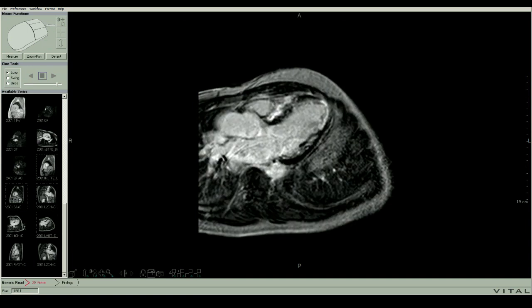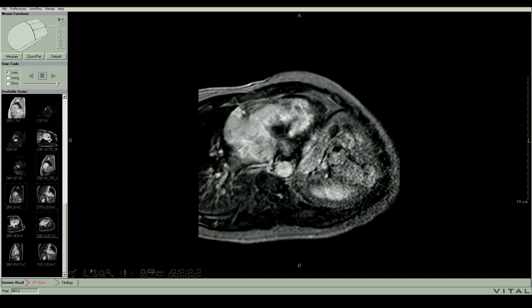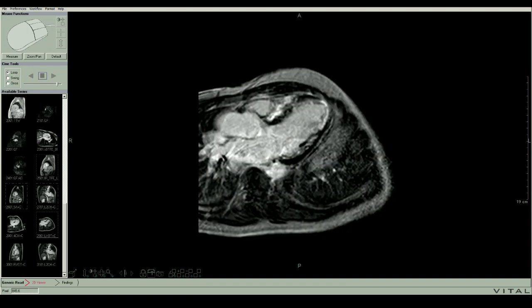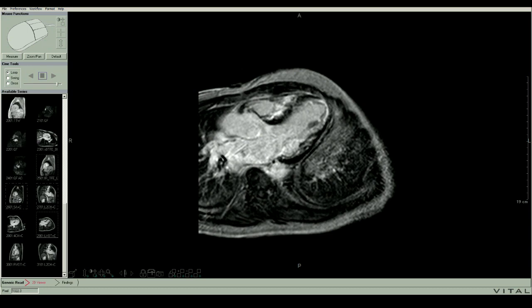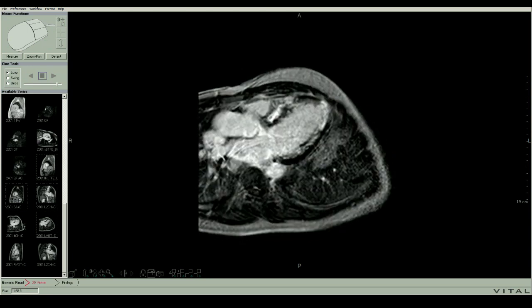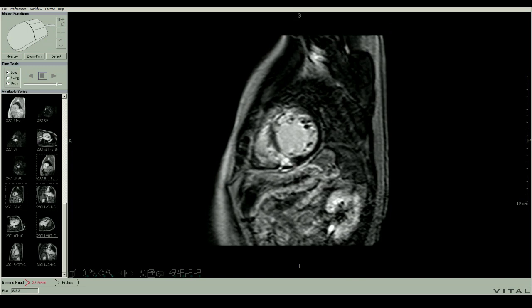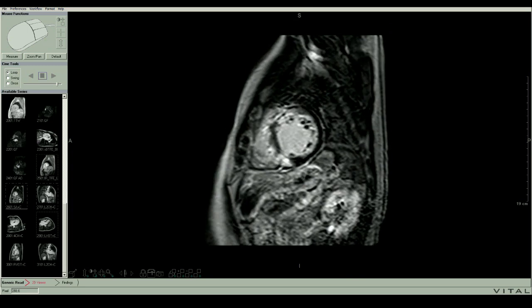That's very, very bright. And then as we go through here, so apex, subendocardial, no epicardial, subendocardial, septum, huge hunk of the septum. Let's go look at some more. That's our attempt to null. That's the Look-Locker. Now here's after the Look-Locker.